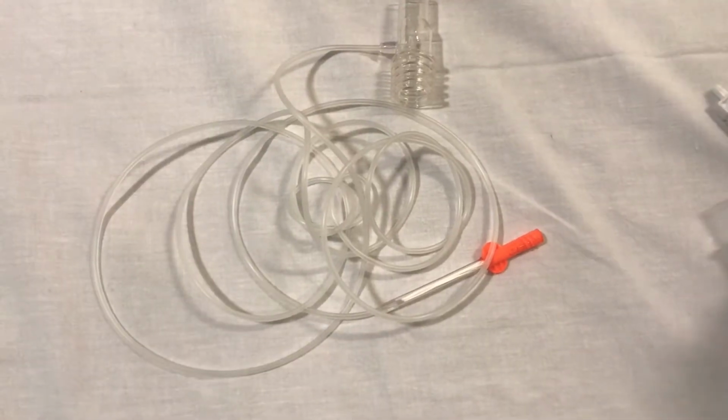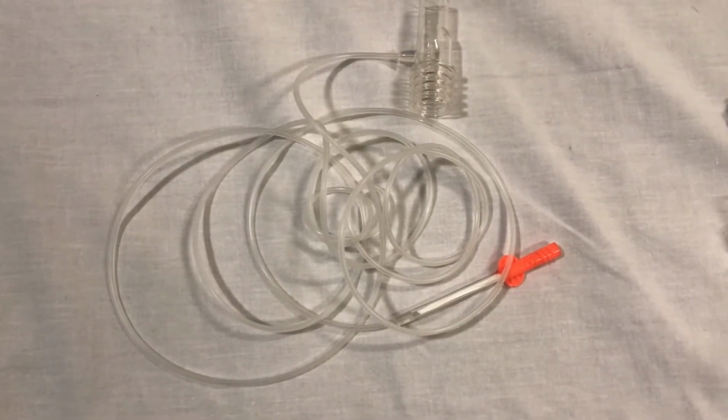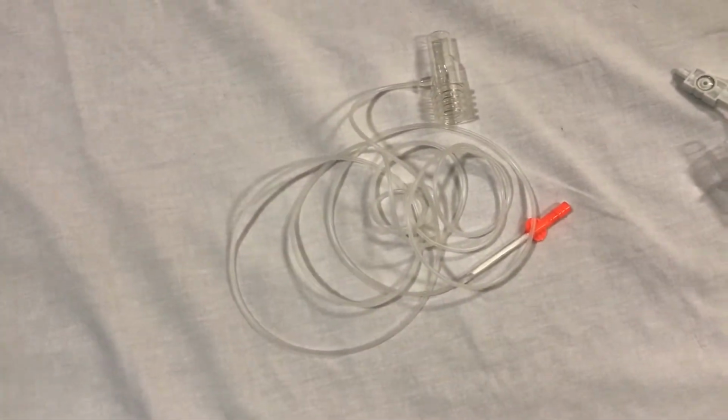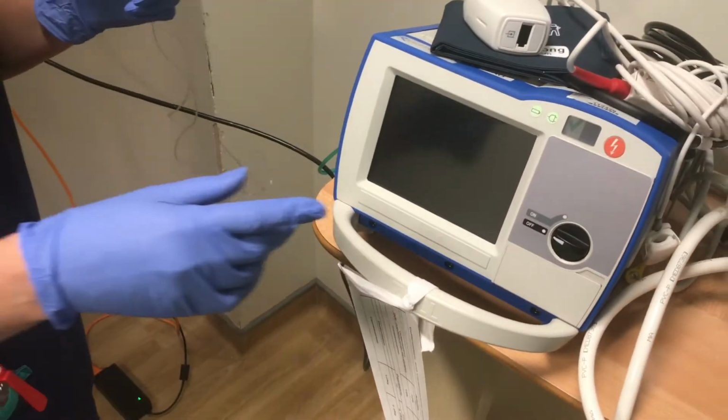We've moved to having Zoll defibs in the respiratory D area, and this is the old style end tidal port that used to connect to the Philips. We've now moved to this style, so just that's a cautionary note. There should be none of the old end tidals left in respiratory D. They should have all moved to this. Charlotte's going to now briefly show us how this connects onto the Zoll.